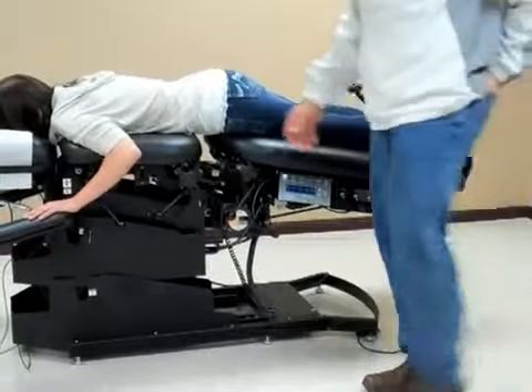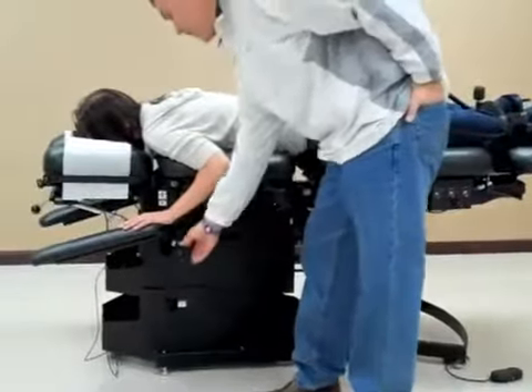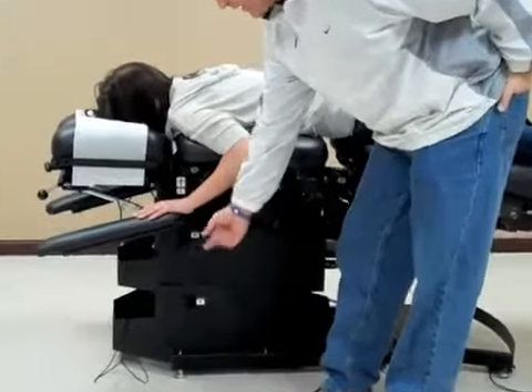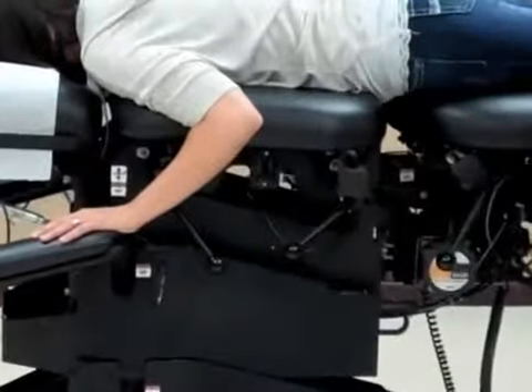Now if I were to leave the room, we have the automatic stop switch here for the patient to push if she wants to stop the table.